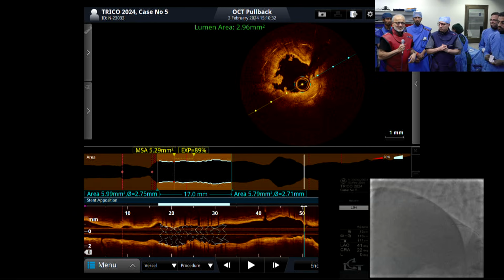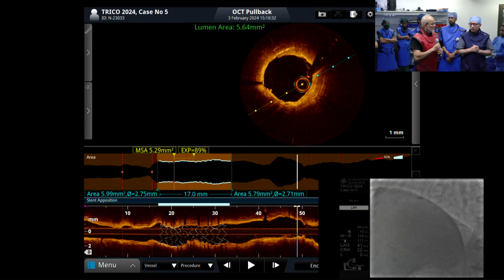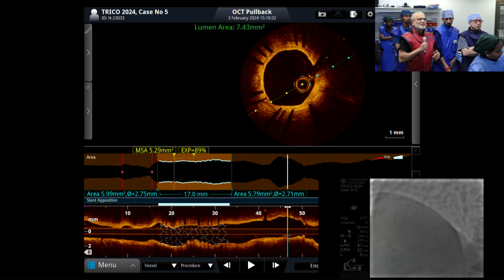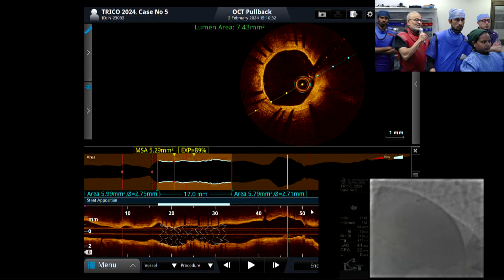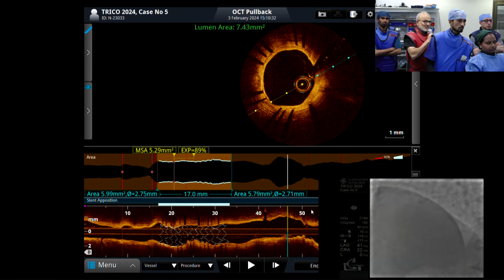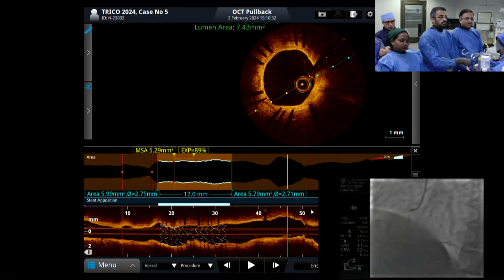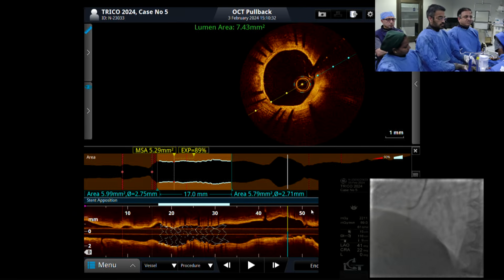So we pull the wire and see. Just a couple of pictures. Let's take a puff, just to make sure nothing mechanically bad is going on. We see the distal areas, Samir, for perforation or something. Yeah, let's puff there. Looks good, right? Remove it. No problem. That branch is having a little delayed flow.